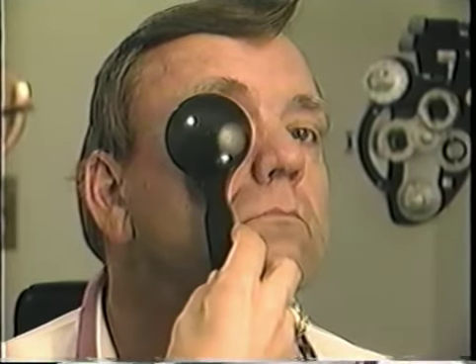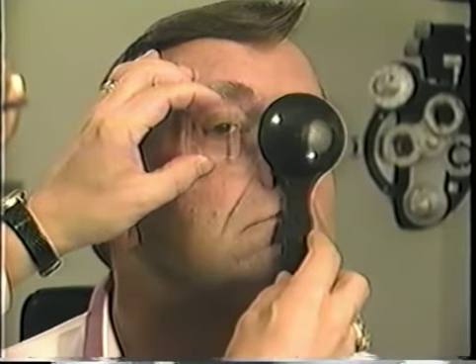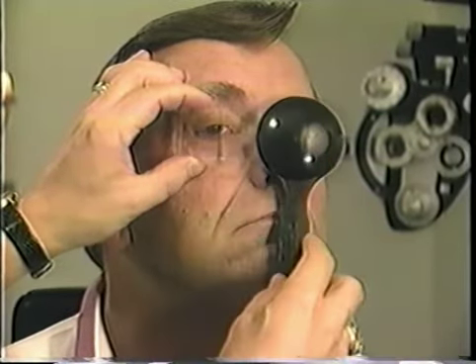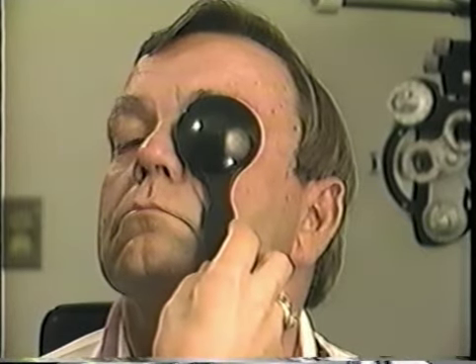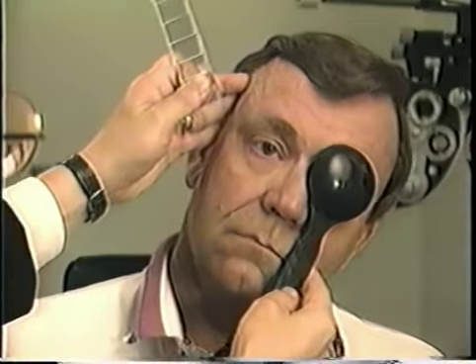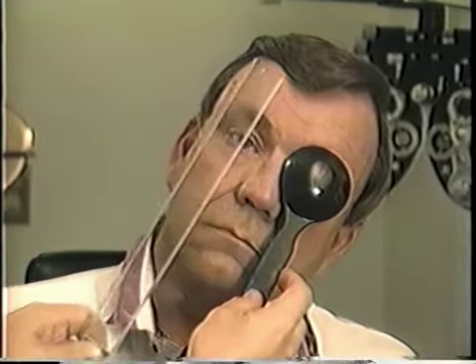The patient has to reach a compromise position in the down and right and down and left gaze positions in order to avoid occlusion of the adducting eye by the nose. Since that position will not always be the same, it is not possible to accurately reproduce these 2 measurements quantitatively. Nevertheless, they are useful measurements in documenting an imbalance. Now measure with the head at a 30-degree tilt to each side while the eyes remain in the straight-ahead position. Finally, perform measurements at near in the straight-ahead position.